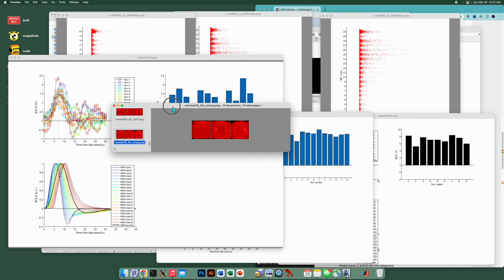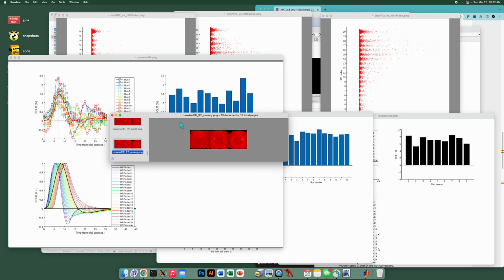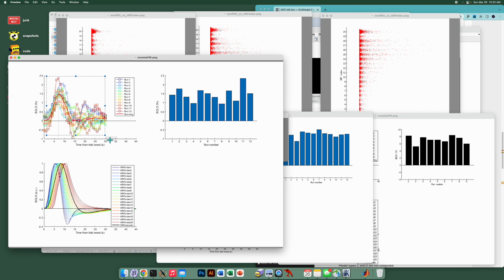Okay, so anyway, I'm showing this because there's an automatic thresholding step based on the distribution of values in this plot. The top 1% of voxels are chosen as kind of a quick and dirty mask, and then we average the time courses observed for those voxels. And that's what we're seeing in this panel.